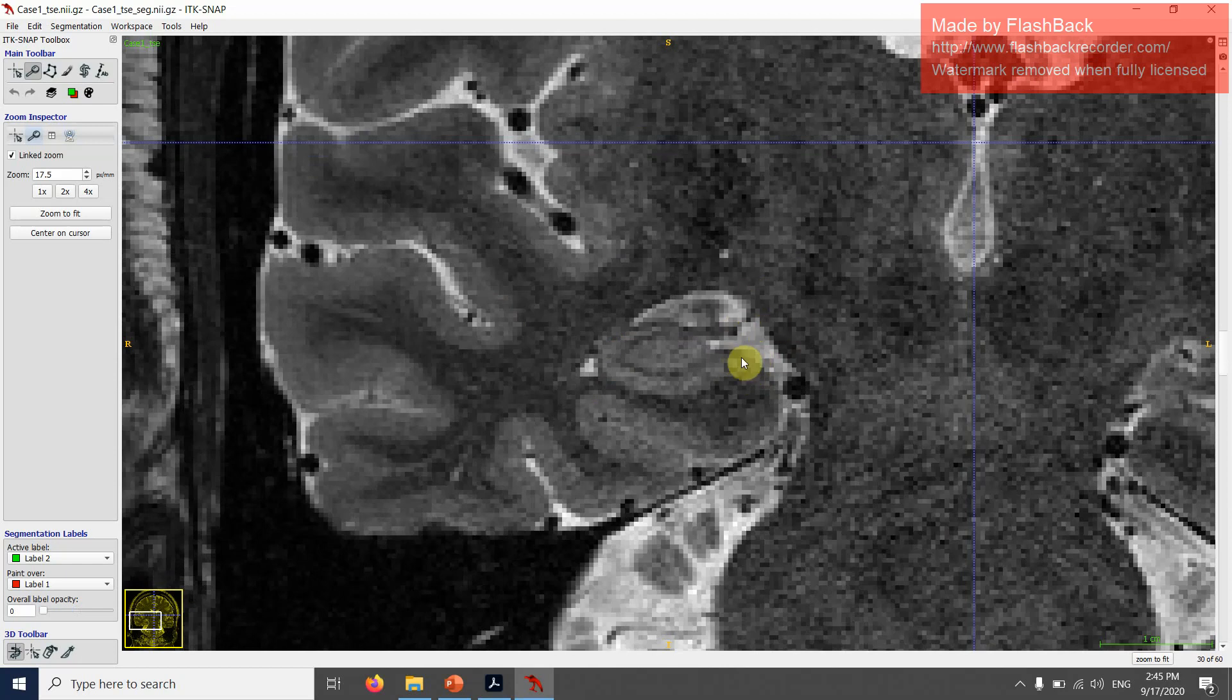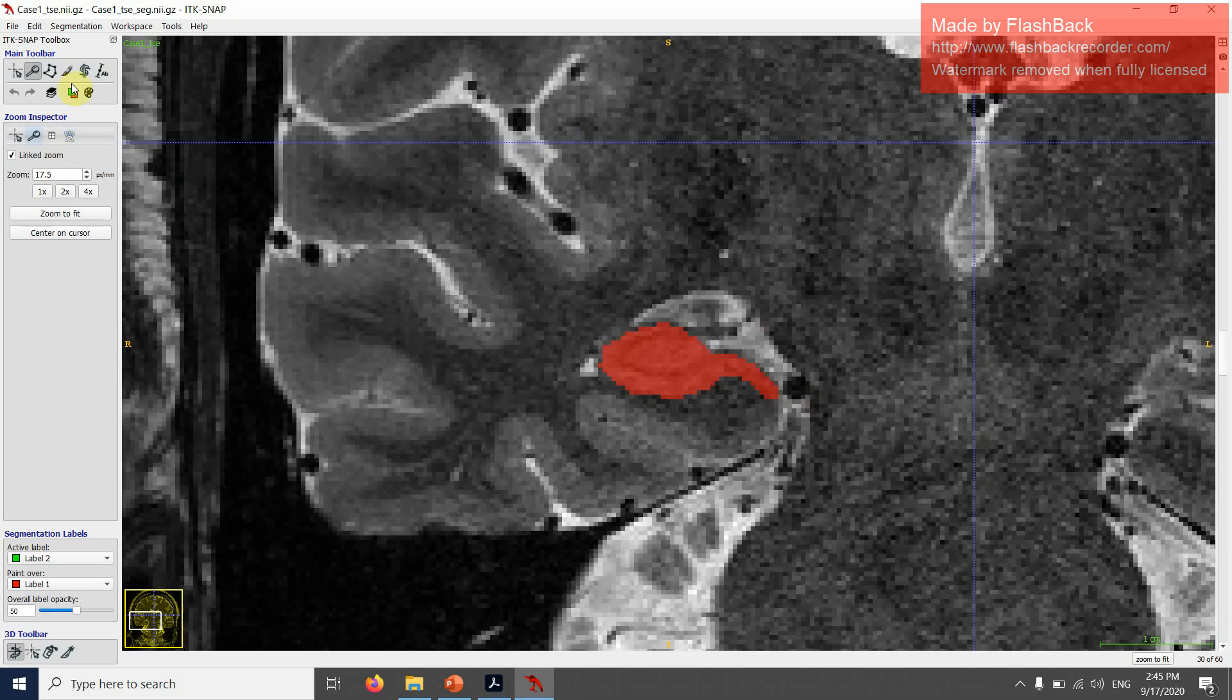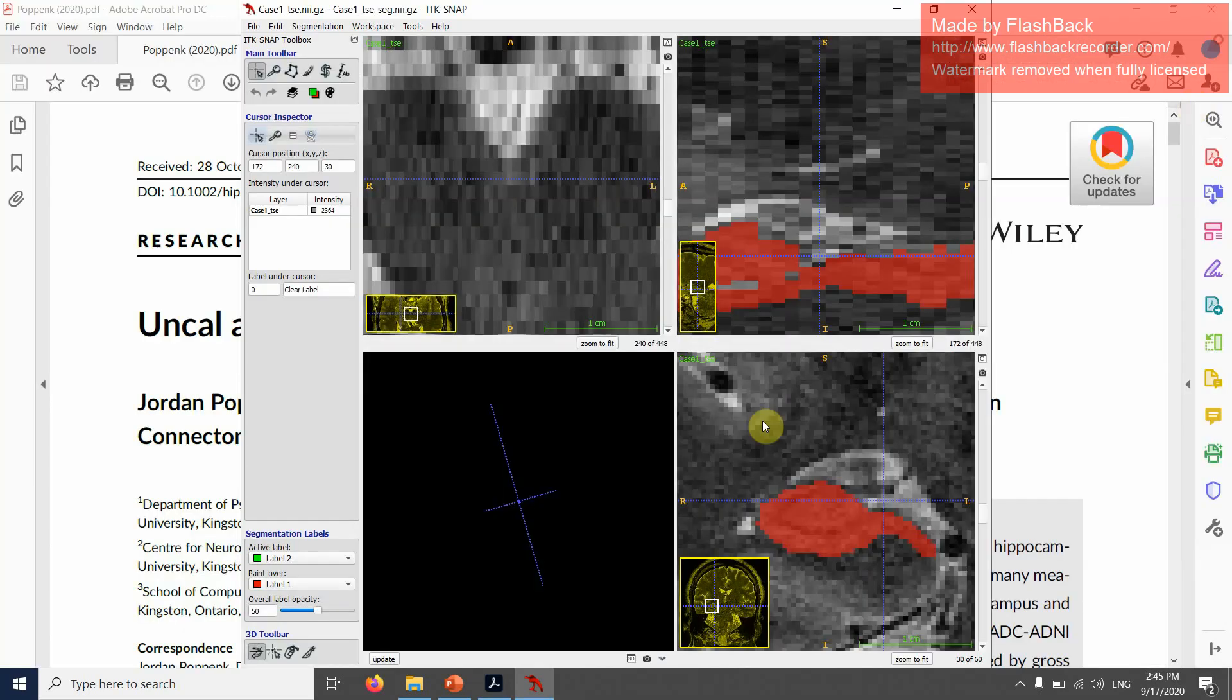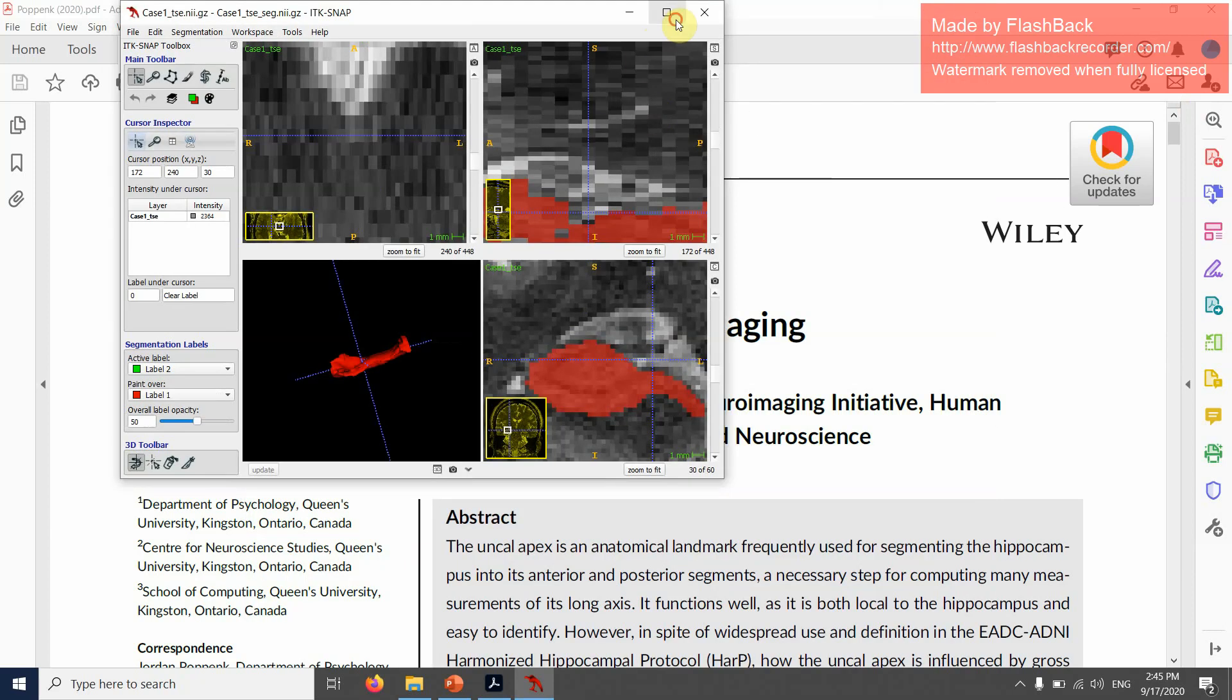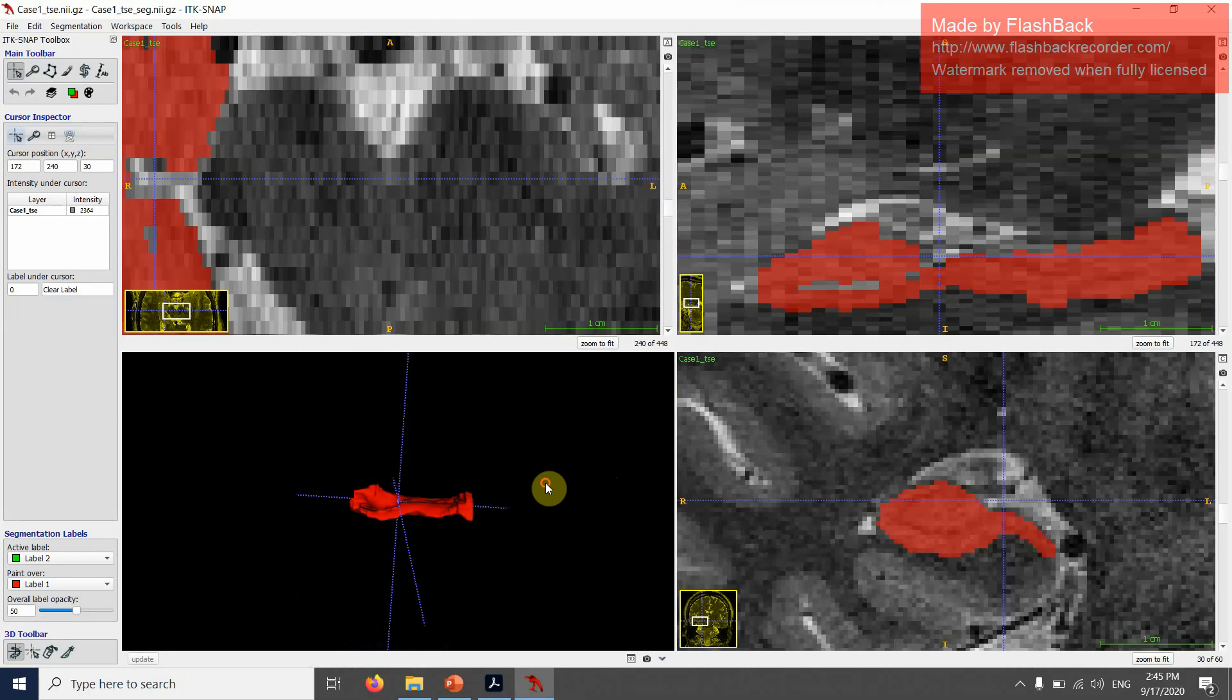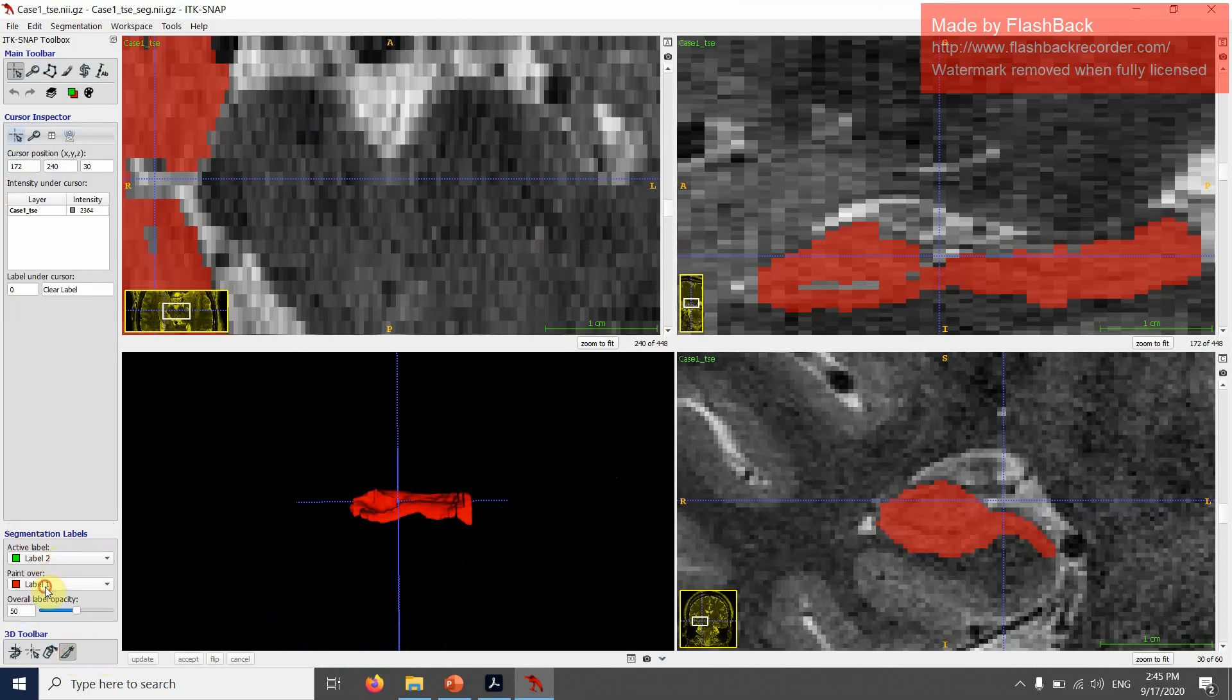I'm going to show you a little trick of how to divide the two. I'm going to go now to the 3D view and I'm going to try and line these two up. Then I'm going to use the scalpel tool and I have here label two over label one. I'll use the scalpel tool here and I'm actually drawing a line over the other two lines.